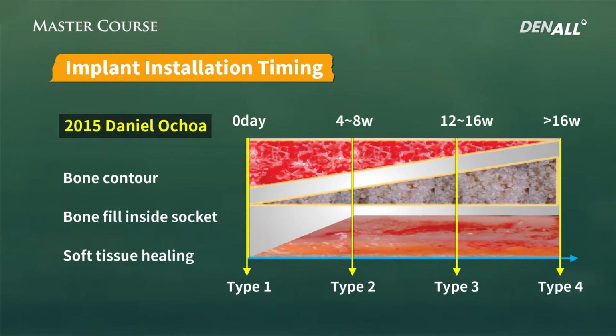I've talked about the implant placement period. In terms of healing, the contour of the bone becomes narrower with time. Inside the socket, bone fill is made with time.